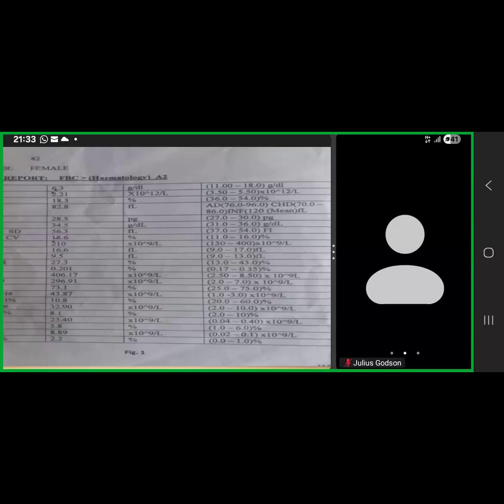I even asked the purpose for which we are having this discussion. We are doing a course on blood film comments. And instead of telling me you evaluate a film, someone was on about BCR-ABL transcripts. And so I asked whether you have that in your facility. And they say, oh, we will source it. And then suddenly no one is talking about that any longer. And we have said over and over again, if your full blood count results are deranged, your next point of call is the peripheral blood smear.